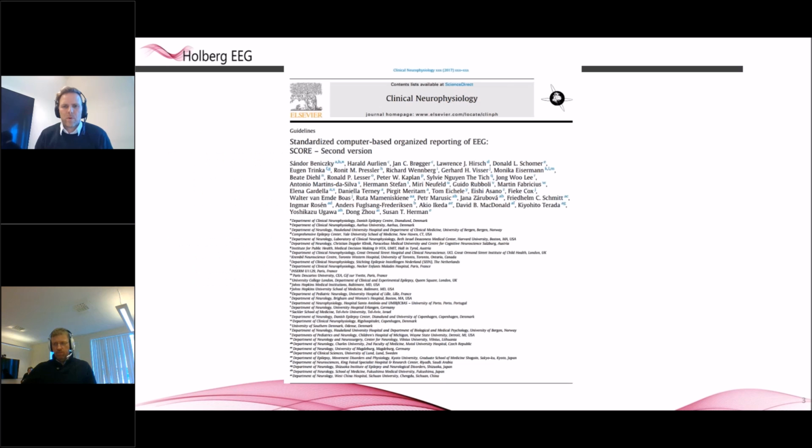So initially, I just want to say a few words about the SCORE standard. What you see now on the slide is the front page of the latest SCORE article, which was published in Clinical Neurophysiology back in November last year. This is tremendous work that has been going on for the last 8-9 years, starting as a European initiative with a publication in Epilepsia in 2013.